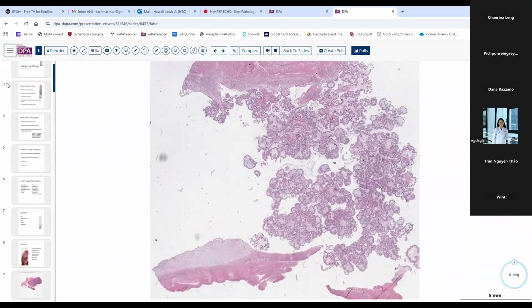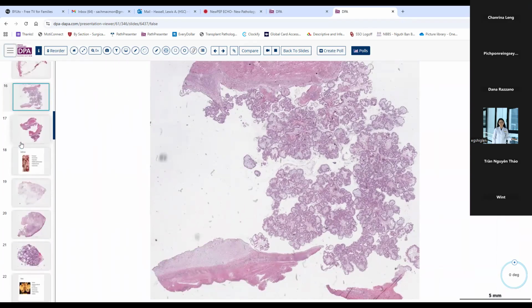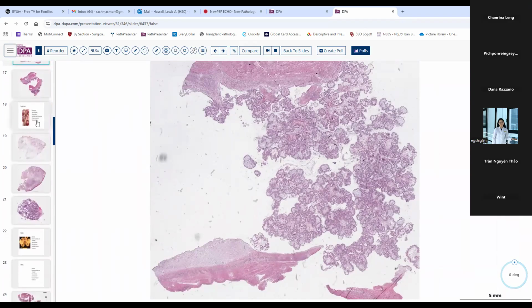You can have a serous carcinoma that is not coming from the fimbria, but once I see a normal fimbria, I feel that this may not be your typical high-grade serous. But yes, just the importance of gross examination.